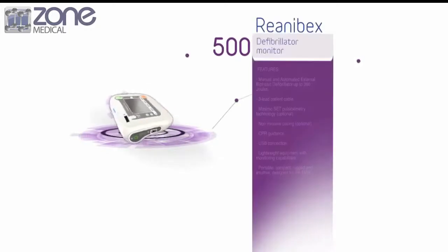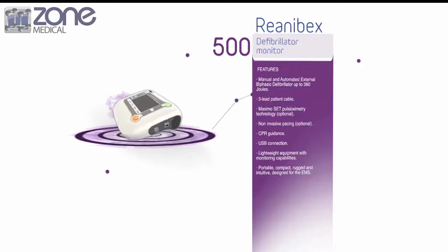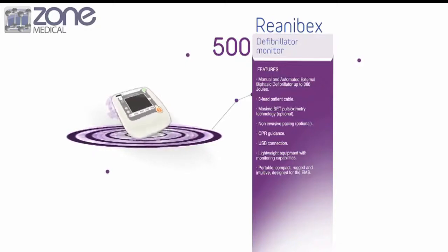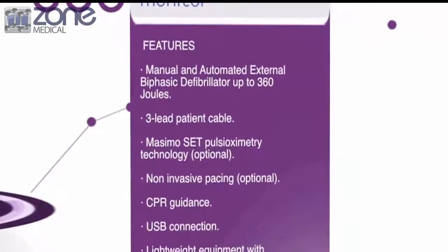Today I'm going to be giving you an introduction on the Renibex 500. This device is a compact, robust and intuitive defibrillator, which is also designed for the emergency services. It incorporates all the necessary characteristics for being used in emergency situations.